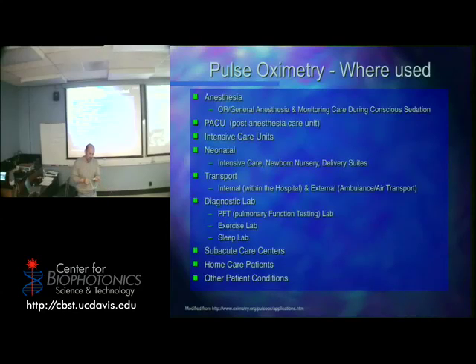Okay? But this is from a company that does a lot with this, Masimo. And this one, basically everything has been built in there. All they're doing is supplying power and getting a reading out of here. So there's the LEDs in there. Both LEDs are in there. And the photodetector is in there. Okay? So take a look. Here, I'll pass it this way. Okay, so, yes.